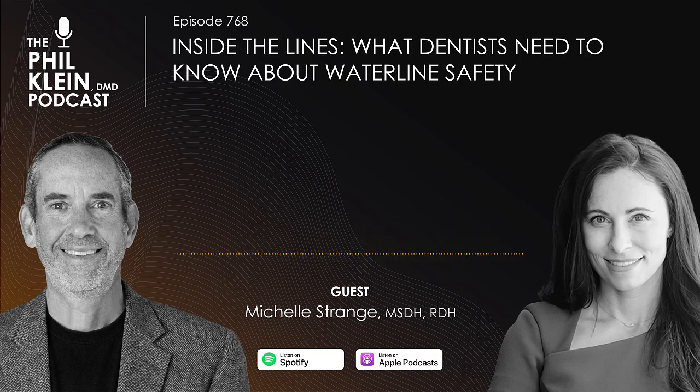No matter what, I test and immediately shock. I do not even wait for my results because it doesn't matter. No matter what, I am shocking. It doesn't matter if my patient comes in and they have all threes in their mouth and no bleeding. I'm doing a perio maintenance that day, right? So it does not matter. I am going to shock.